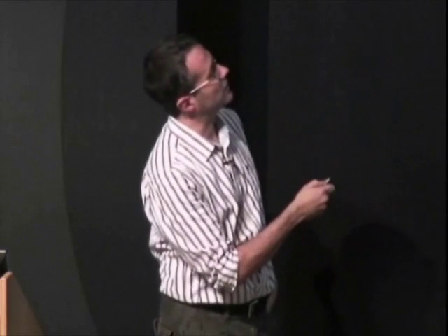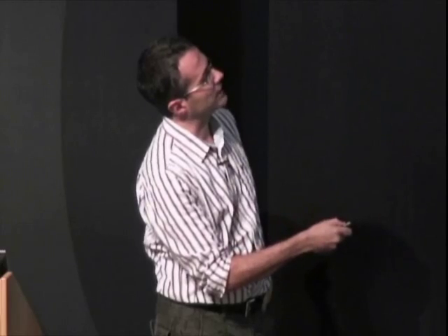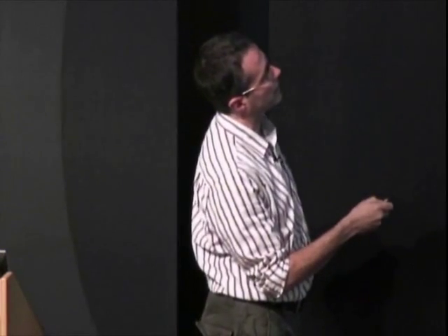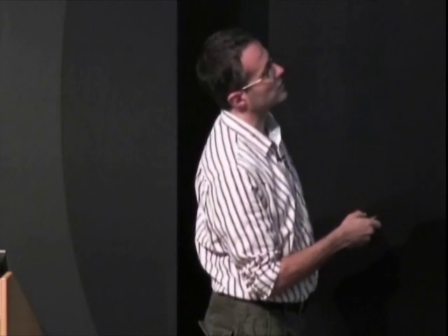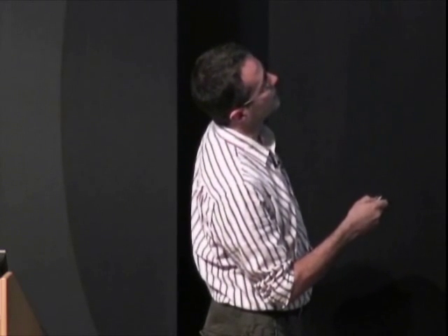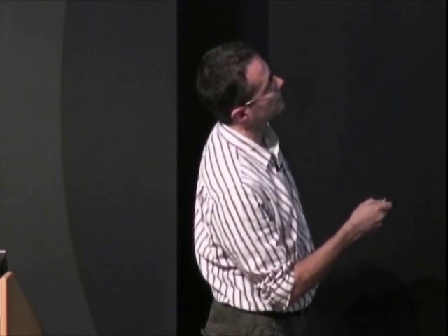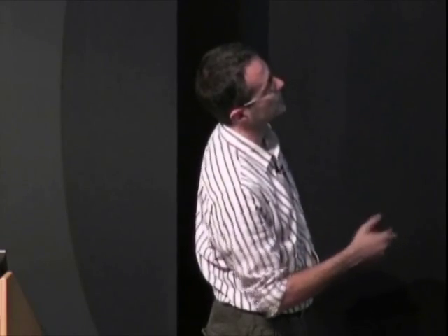It's clear that the active cells are always bright white, at least in this, it's called T1 gadolinium modality. But actually, there are many cases like around this blob where they're not so bright white. There are many cases where the appearance of the tumor and the necrotic core is very different from other cases, like in this one. Compare this one to this one, for instance.